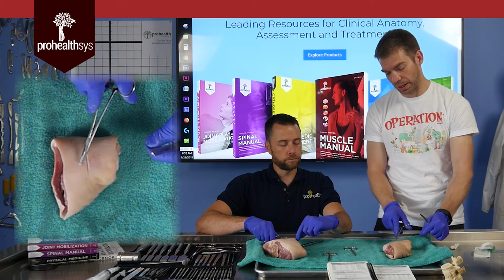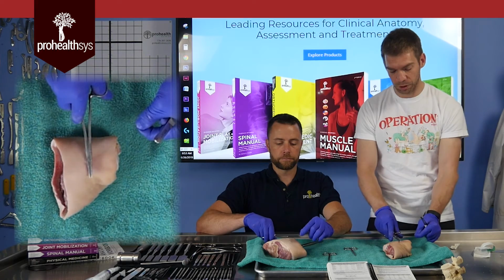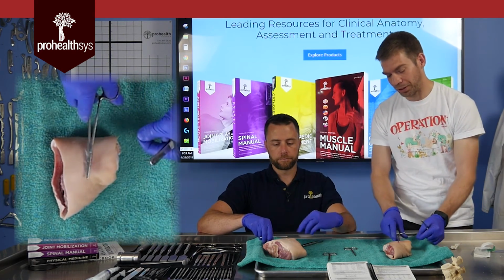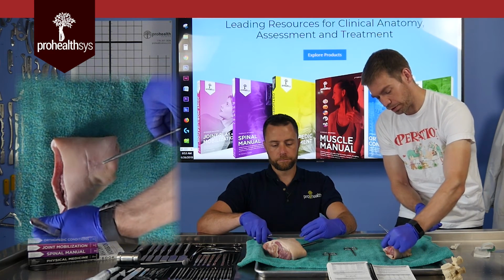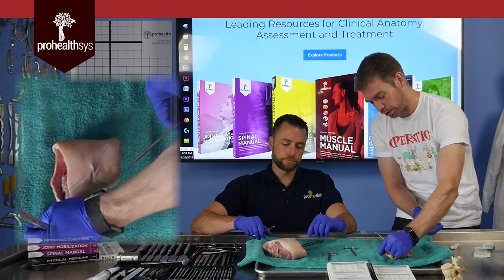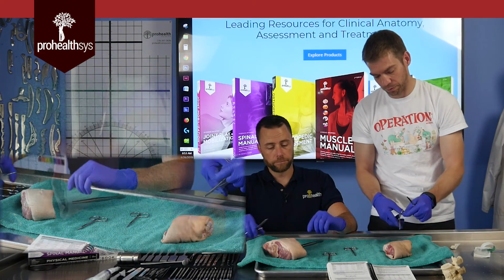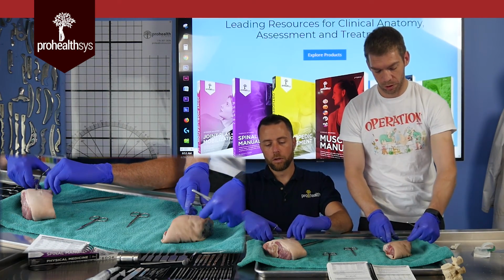I'm going to grab the end, that little bit of end that's left, lock it shut, and then go from perpendicular over the wound, parallel over the wound, to perpendicular. I'm going to pull the knot against itself, and there we've got a nice knot. Okay? So the next thing, all you do is repeat that motion. Needle driver in the center, knot around.